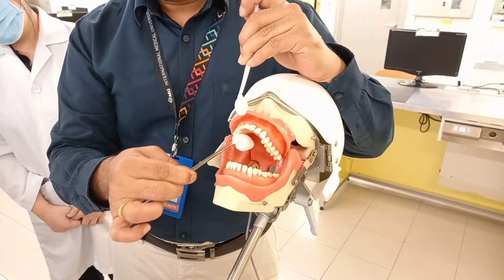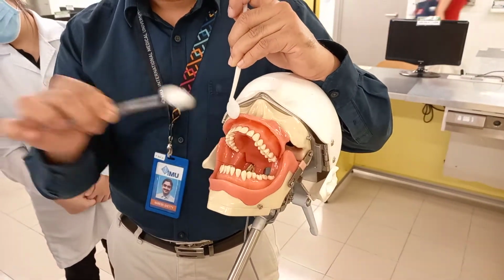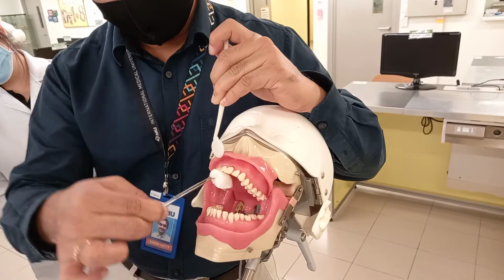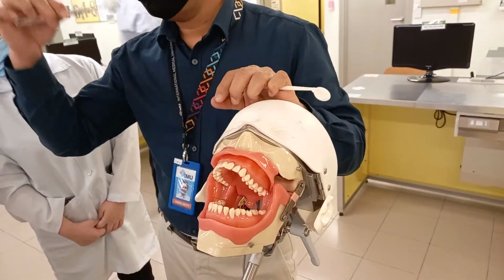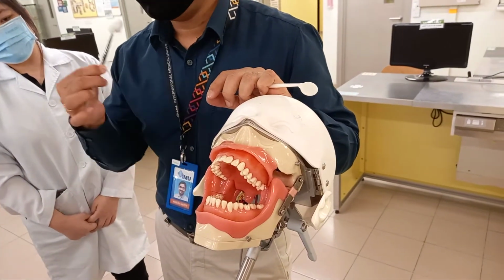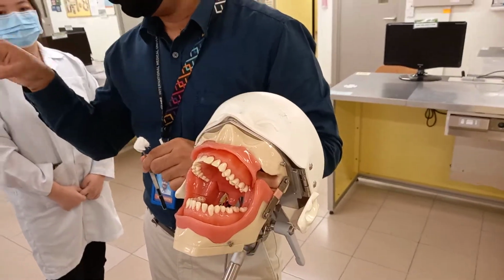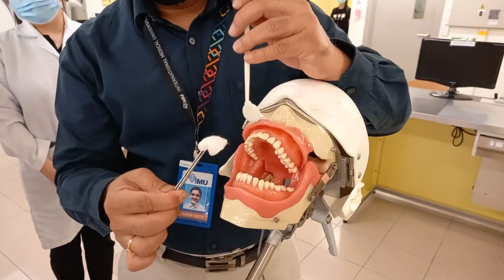When you remove it here, don't do it this way. You go into the throat. This one causes a gag. So do it inside out. If you do it this way, there are chances that you go into the tonsil. If anesthetic solution falls inside the tonsil, the patient will start coughing continuously and have a gag. If that happens, ask the patient to drink water and gargle, so the water will dilute the drop of anesthesia. Going out, here is very simple.